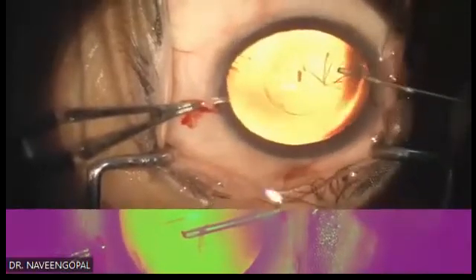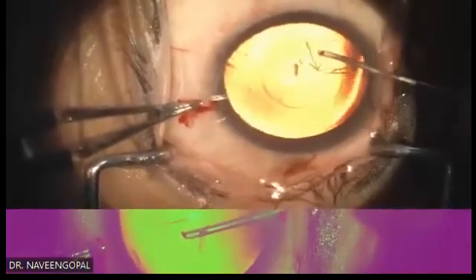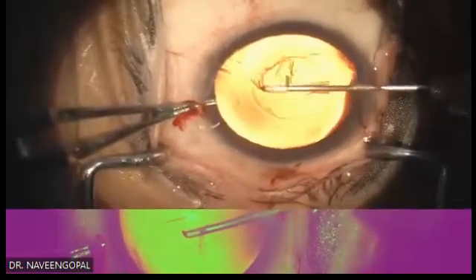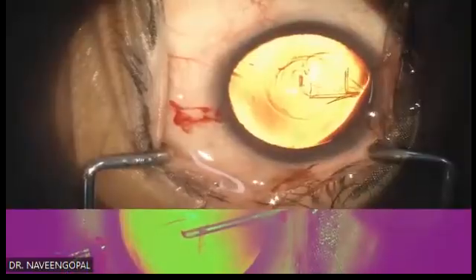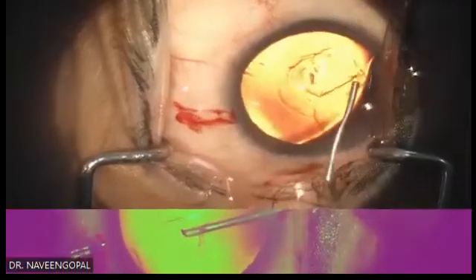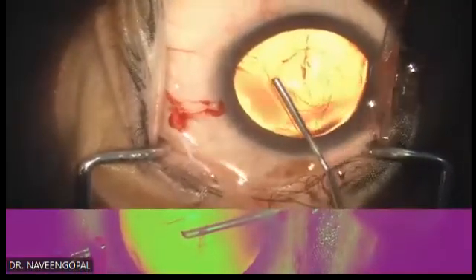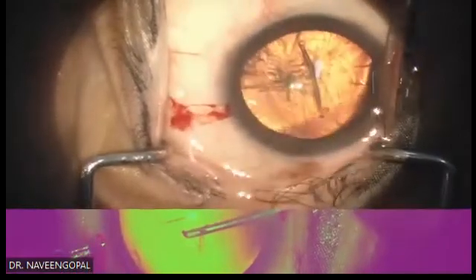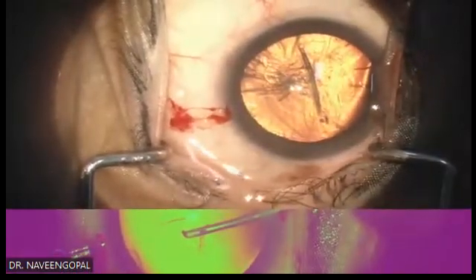Small rhexis, around 5 millimeters. Aim for 5 millimeters, not more than 5.5 millimeters maximum. As you can see, it is perfectly round, 5 millimeter rhexis. This is the key in multifocal. Decompress the AC. Follow your basic rule. This is hydrodissection. See the wave. Decompress. Come out. Put the visco.